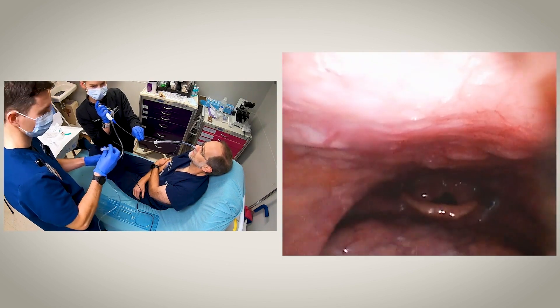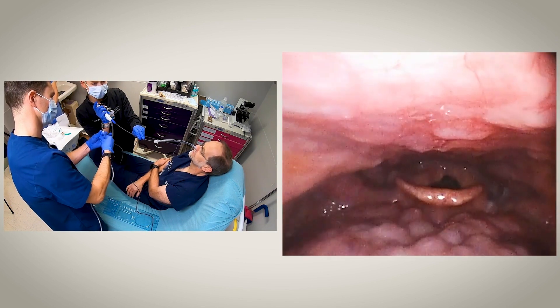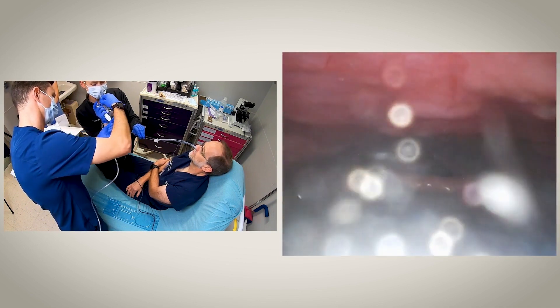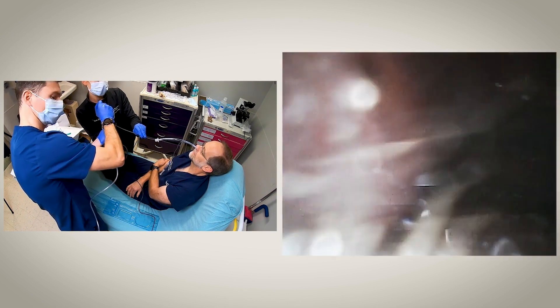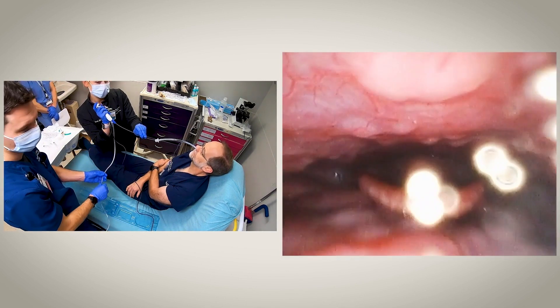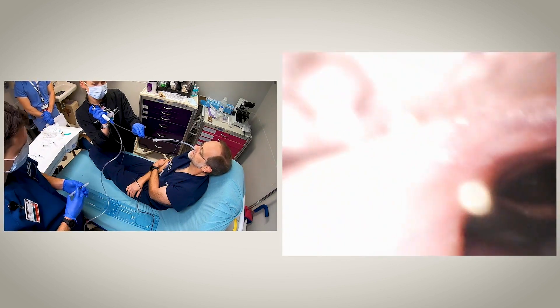This is where we'll make our first injection of 4% lidocaine. Remember to have your assistant kink off the oxygen tubing, because if you don't, it will squirt back up through the scope. Have your assistant attach the lidocaine and then inject it. This is 1 mL of lidocaine with 4 cc's of air so that the lidocaine will come out of the tip of the scope. We'll then give that a second or two to take effect and continue advancing the scope.